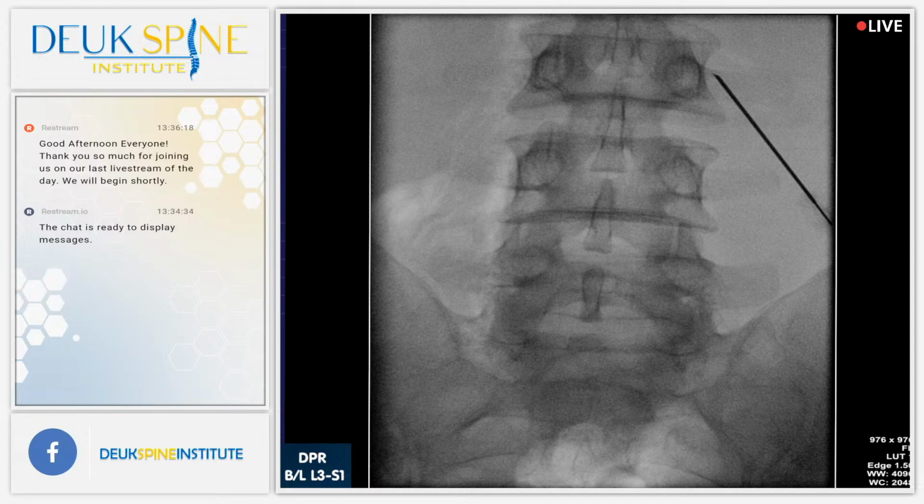Pressure. Hold it down. Give me an opening. There you go. Nice. Okay. Off.